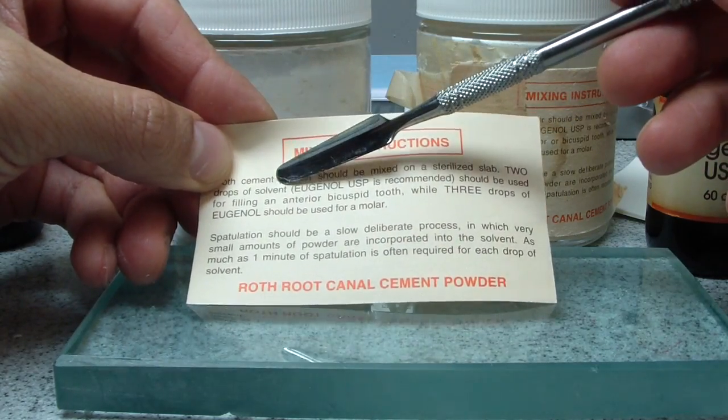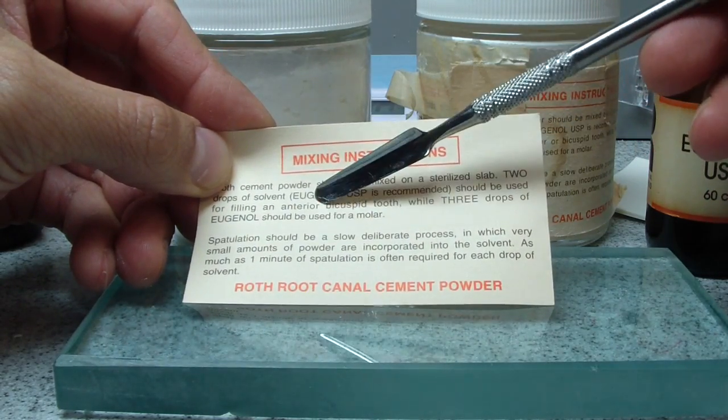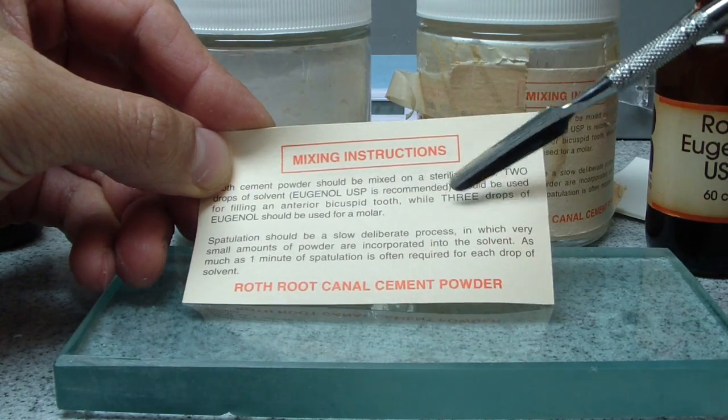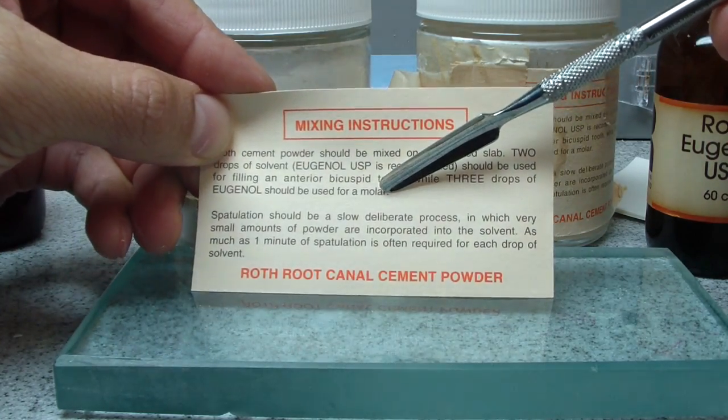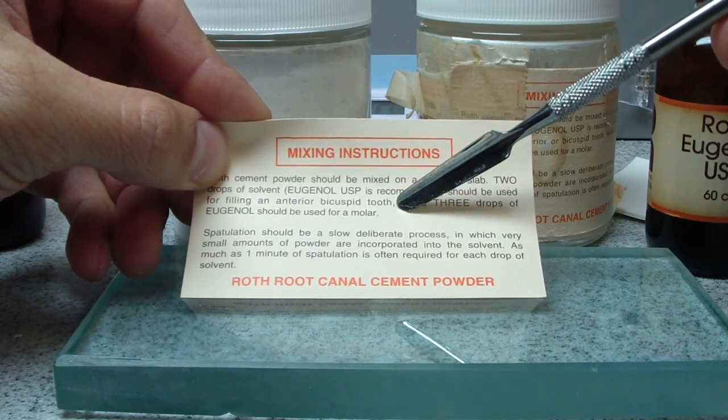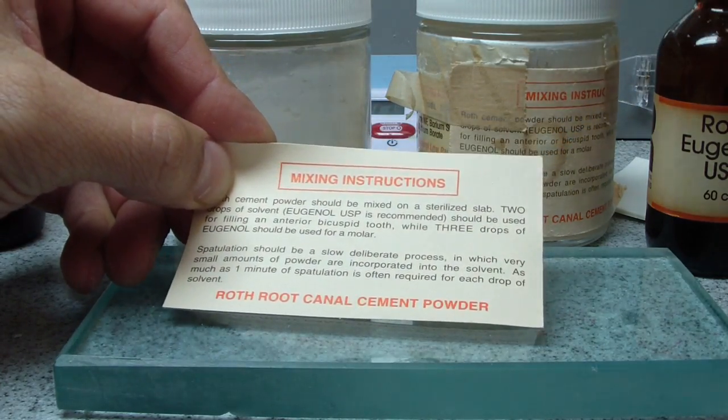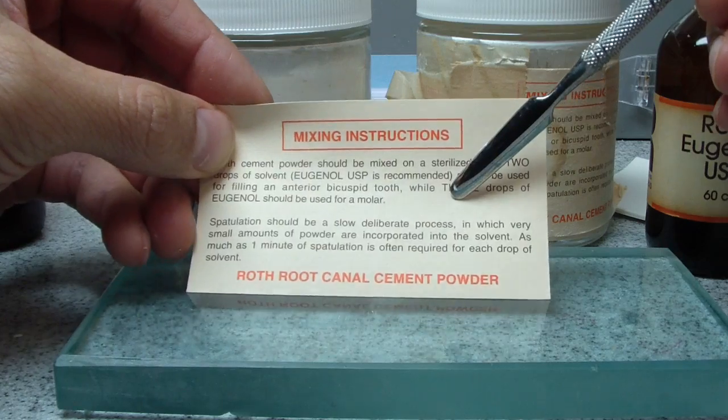So it's just a little tip. I mean, I guess it has some applicability to endo. So, take two drops of solvent, of eugenol, for filling an anterior bicuspid tooth, while three drops for a molar. Not sure—it doesn't say whether or not this is for lateral condensation.